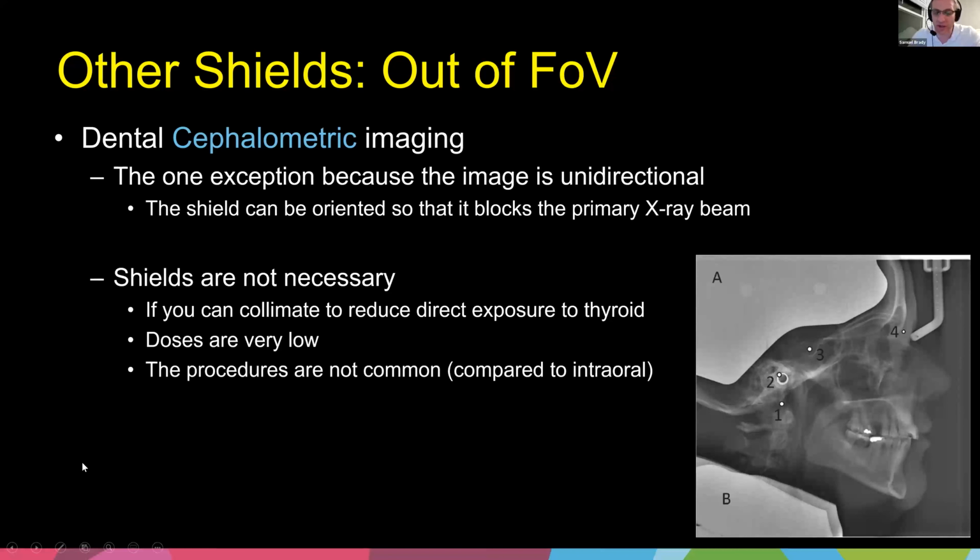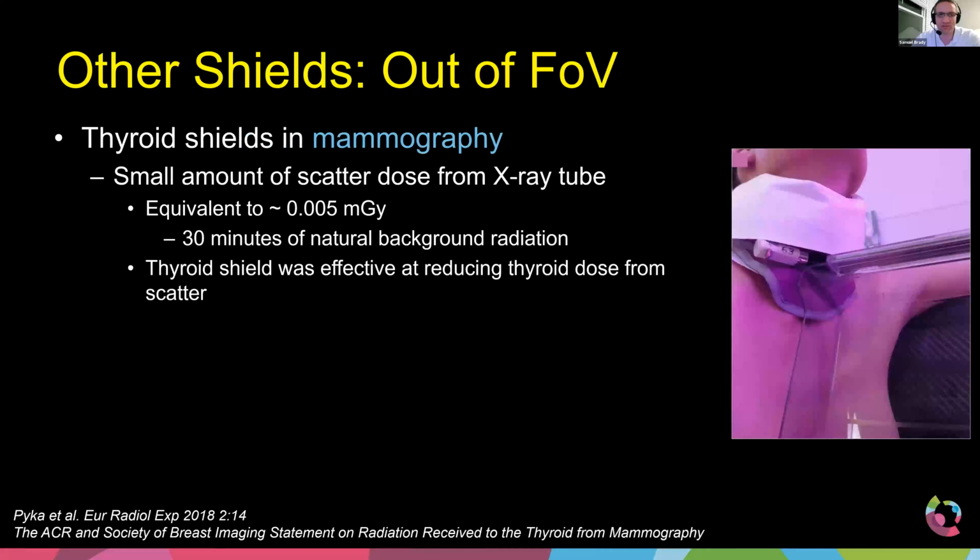Now, I would make the argument that once again, dental imaging is incredibly low dose. And the cephalometric imaging is relatively speaking rare compared to intraoral or even panoramic or cone beam. We just don't do as much cephalometric imaging. Therefore, the risk to a population, to those people in the Thai population that come in to get this imaging, is pretty darn low.